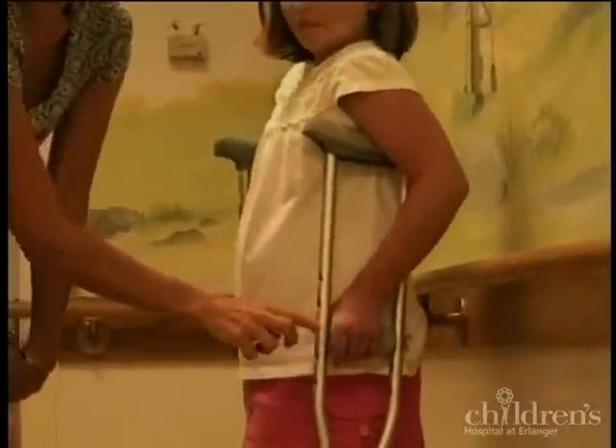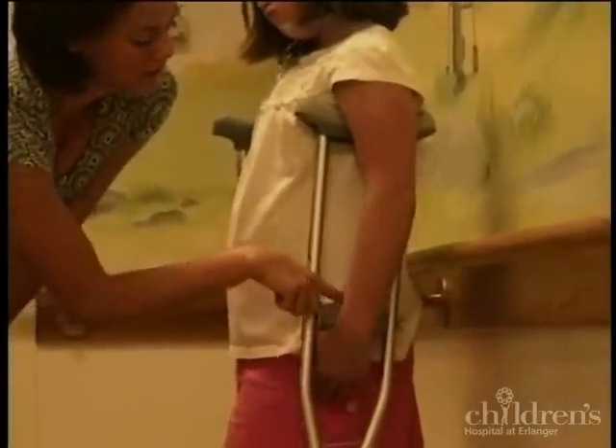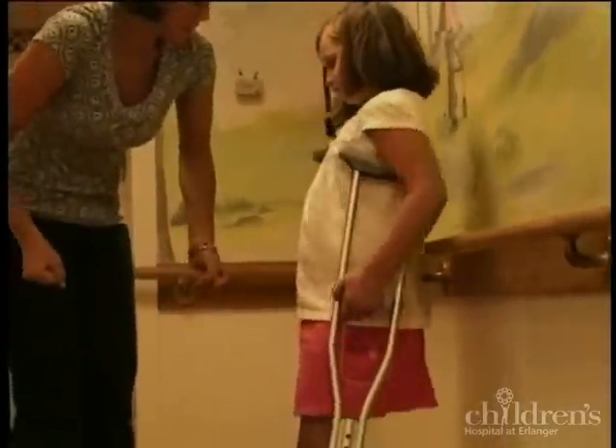Go ahead and let your arm just go straight. You see how the wrist is level with this pad? We need that so that she can get a good grip.